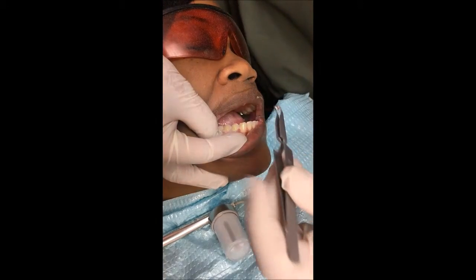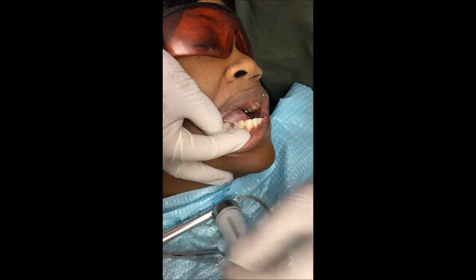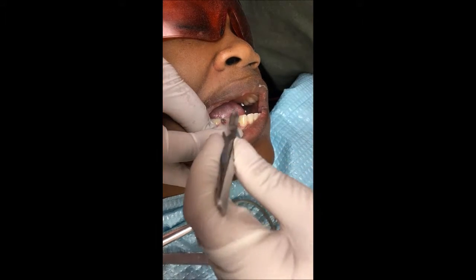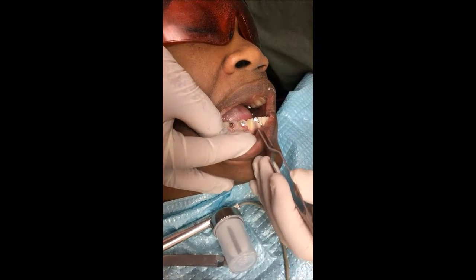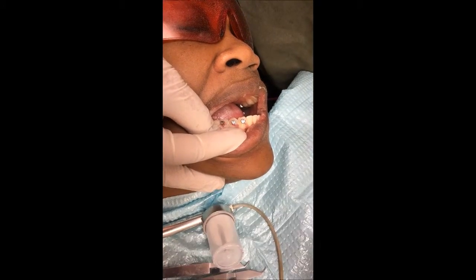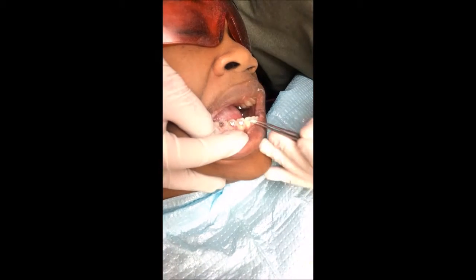Place the brackets. Notice the vertical post is towards the mesial. We then position the brackets with a slight inclination mesial.